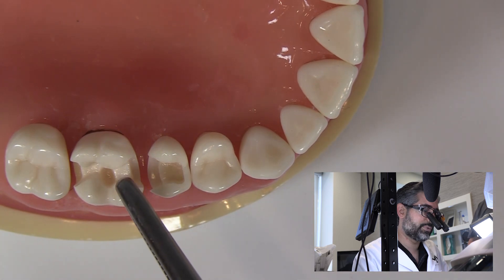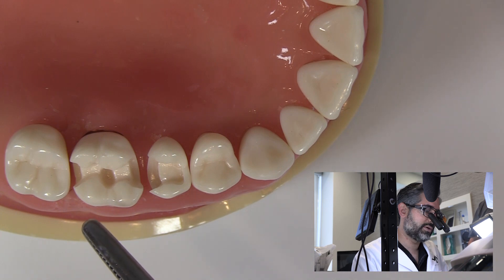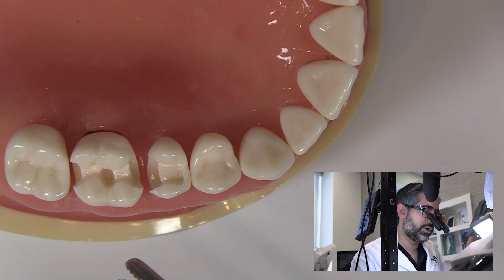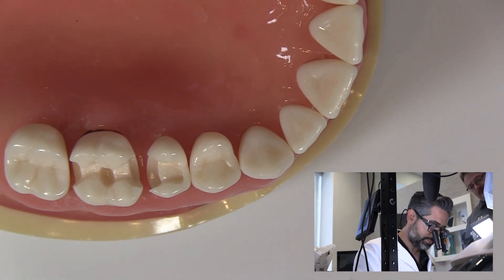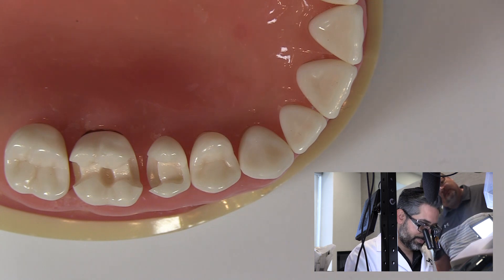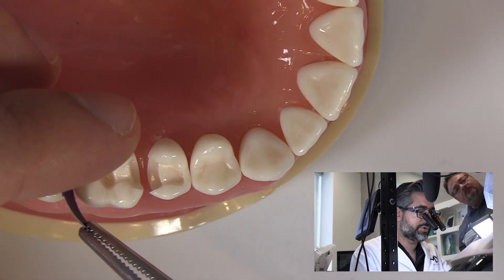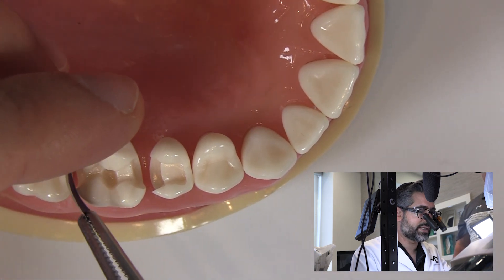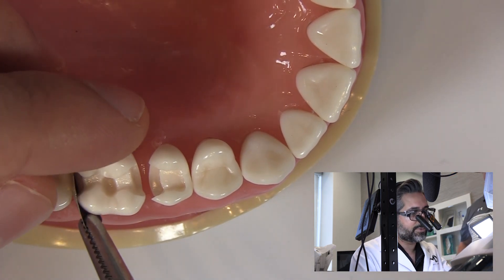So even when it comes to an M.O.D., let's take a look at this example here. In a case like this, I'm going to place the matrix band on the mesial and the distal, but I'll put my ring on the contact that I'm working on first, and then I'll reposition it to the other side when I have finished building up the wall. So as an example, I'm going to place this matrix band.